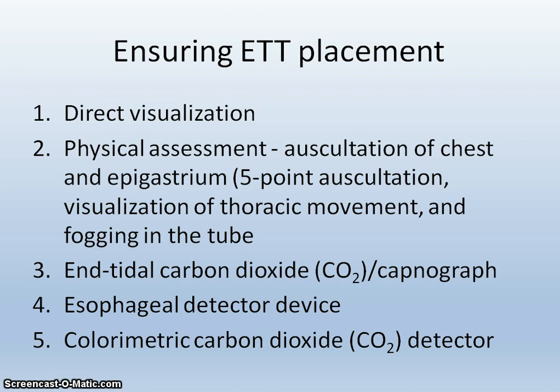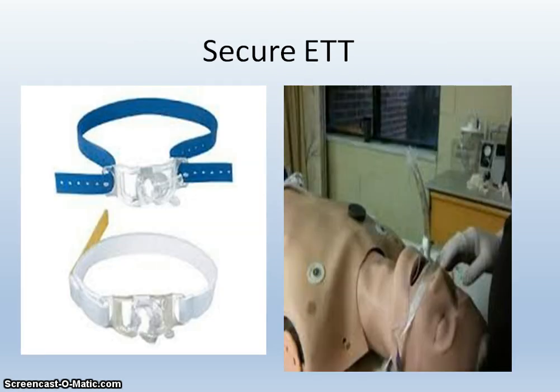Apart from physical assessment, other techniques to ensure the ETT placement are end-tidal CO2 capnography, followed by the esophageal detector device, or a colorimetric carbon dioxide detector. These are some of the techniques for confirming that the tube has gone in place.